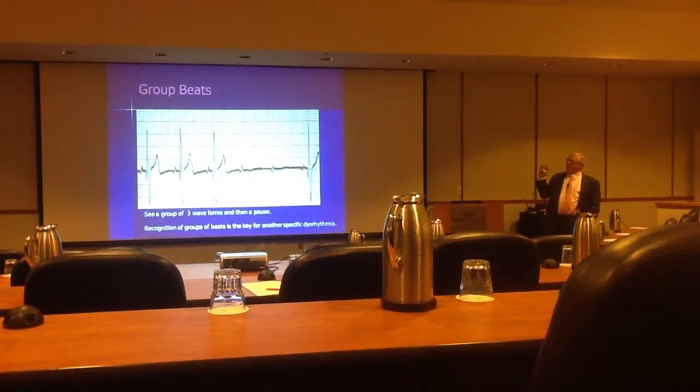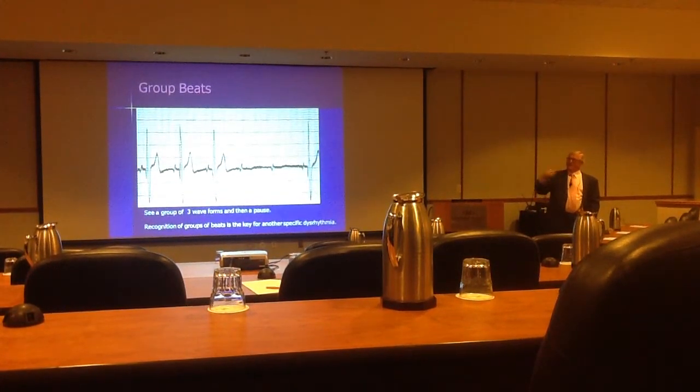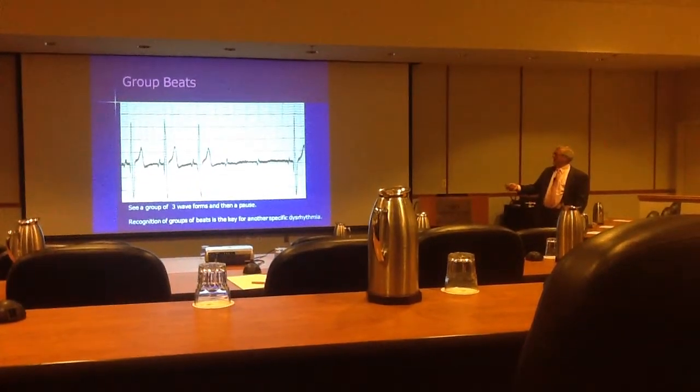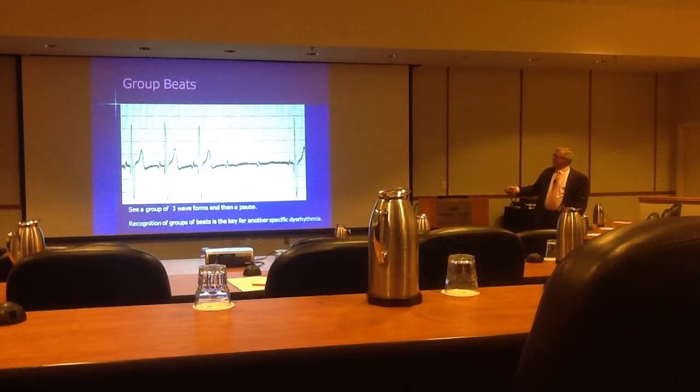So just by getting a feel for what's on the screen, you can actually get a diagnosis to pop in your head that then you can try to rule out or confirm. And then, like I said before, anytime that we see groups of beats followed by any kind of a pause, always think of second-degree AV block.